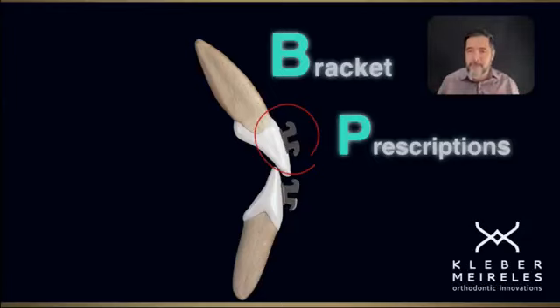You don't have this problem anymore because you have already seen how to do this the right way. But most of the people that I know that can't deal with torque, they complain about the difficulties behind the torque. So they want to have something easier. And the prescription came to our lives like this, to facilitate the way we deal with class 2 and class 3 cases. I'm not talking about standard prescription that we're going to see also, but mostly class 2 and class 3 cases, and what they do for us.